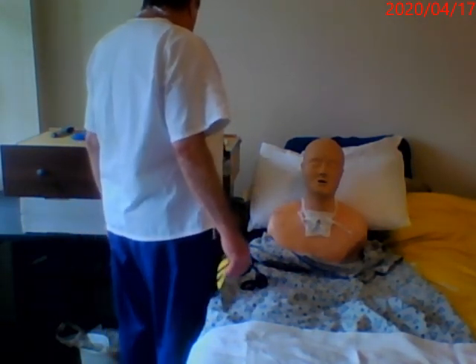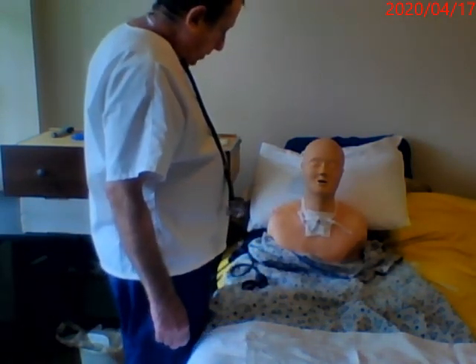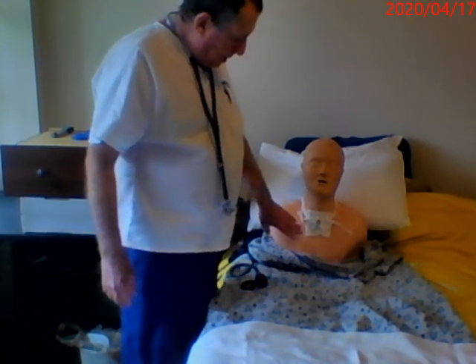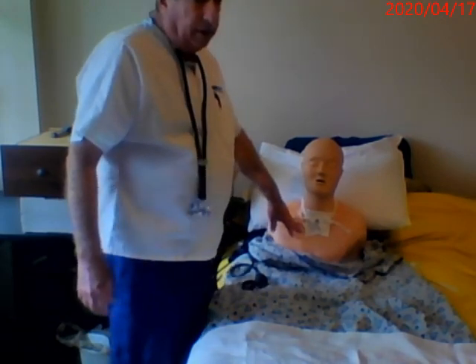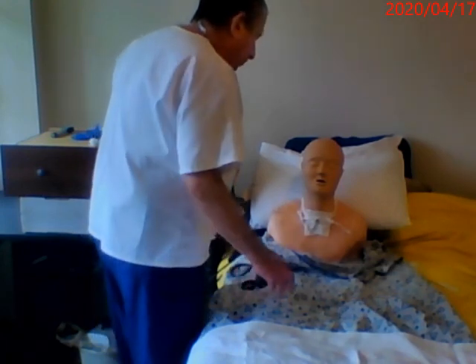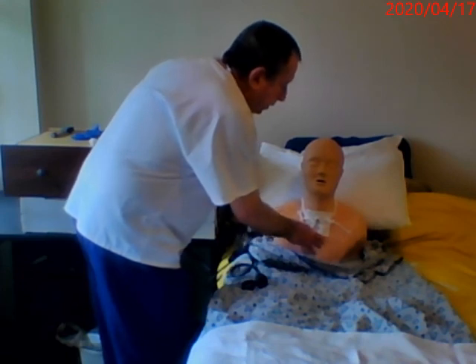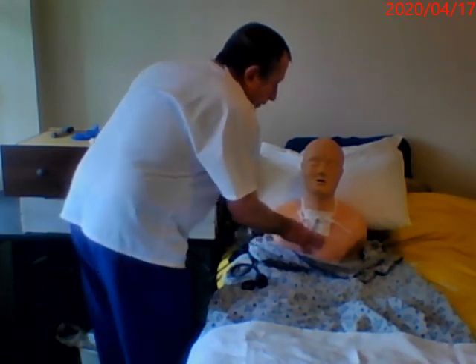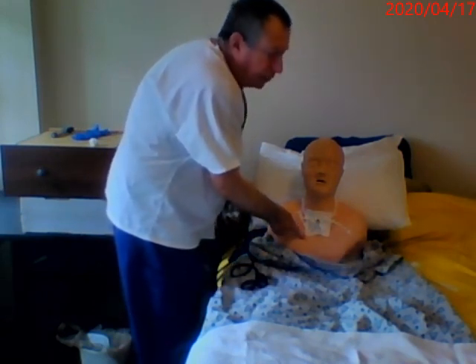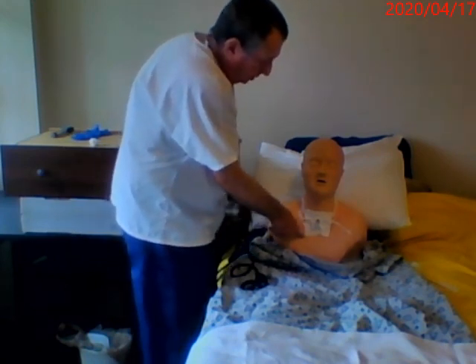I'm going to auscultate his heart sounds. For auscultation, I'm going to find the landmarks. I find the angle of Louis on the sternum and go over to the right, to the second intercostal space on the right, because the angle of Louis is at the second intercostal space.